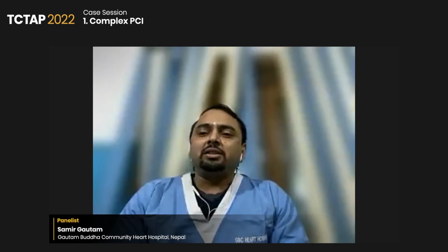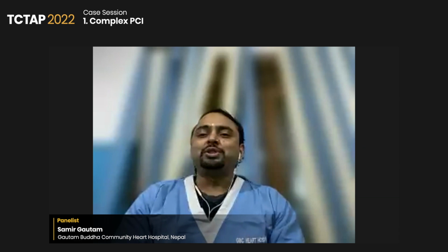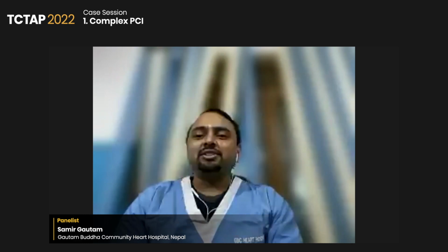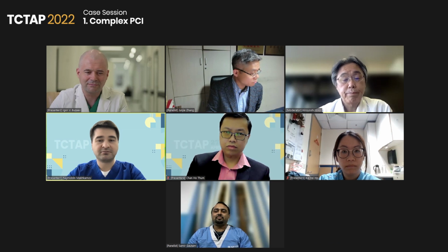And I like that during intervention, it is always good to change the strategy. A single strategy might not work, and you have to be consistent with changing the strategy, as I did. Thank you very much for your comment. As your comment was good, we already wrote in our conclusion, and the last take-home message was the same. Be always flexible.